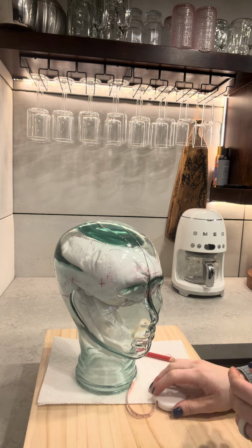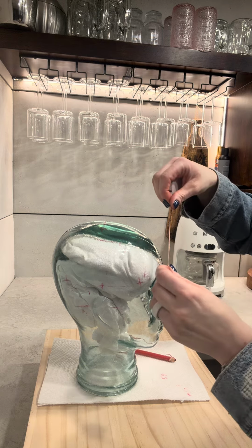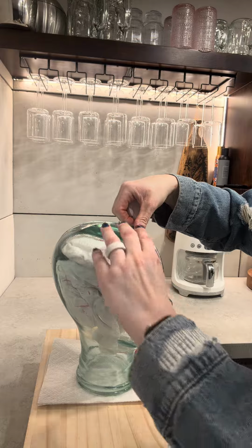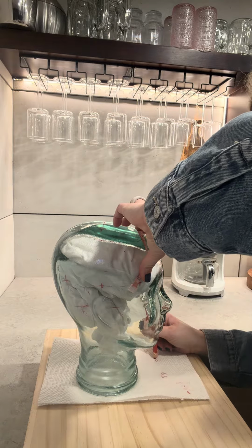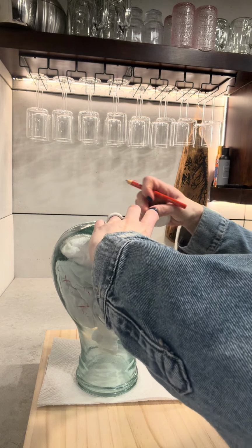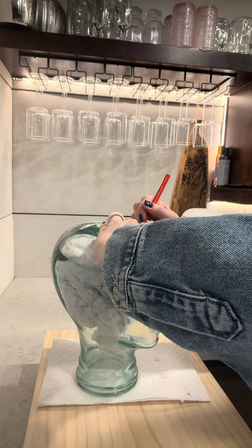Okay, next step is to measure my anterior coronal, which is from F8 through Fz to F7. It's 21. Okay, so 10.5. And the whole measurement I'm gonna divide by 4, which is gonna be here.